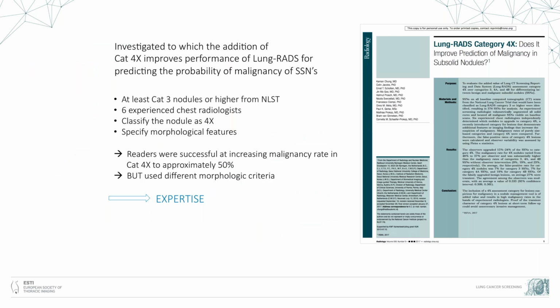I suppose most of you are familiar with this study published in Radiology. This study investigated to which extent the addition of category 4X improves performance of Lung-RADS for predicting the probability of malignancy of part solid nodules and subsolid nodules in general.